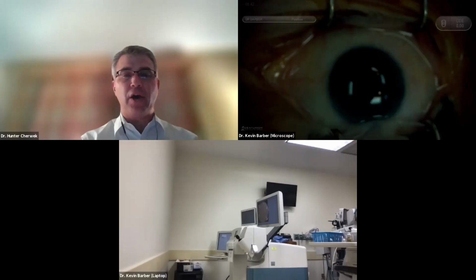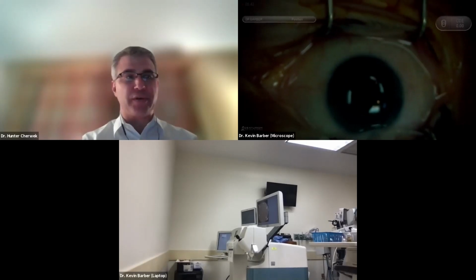Yeah, thank you, Kevin. And as always, I really appreciate you taking the time and making the team approach to cataract care. In this case, Kevin has selected a 63-year-old patient with bilateral cataracts, and the patient has mild to moderate open angle glaucoma. The patient is hyperopic, plus 3.75 was the best corrected vision, and the vision before surgery was 20/50 in both eyes. When Kevin did the gonioscopy, there was a mildly narrow AC, which we would expect in a hyperope, but he was able to see the scleral spur 360.